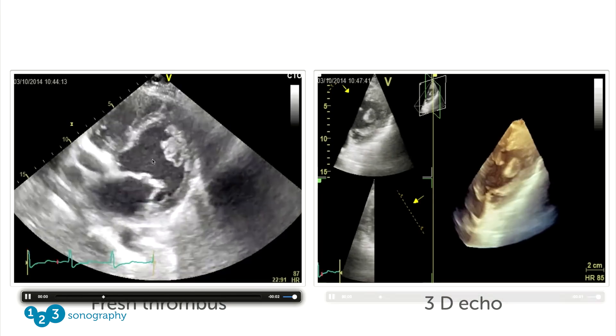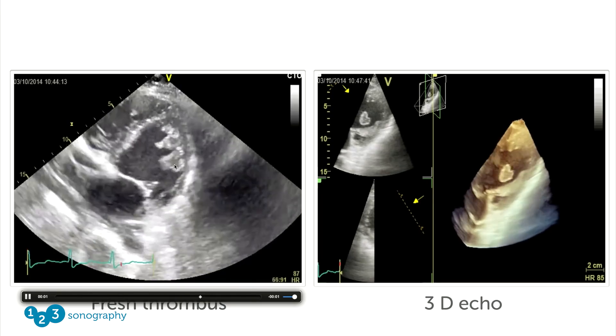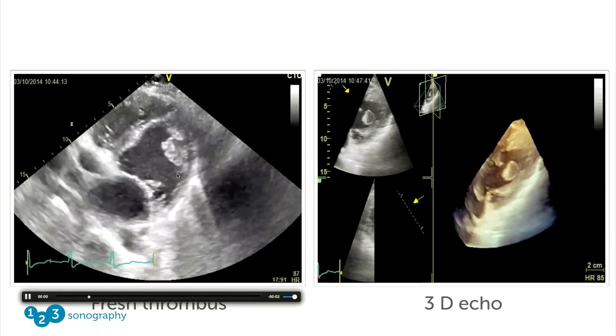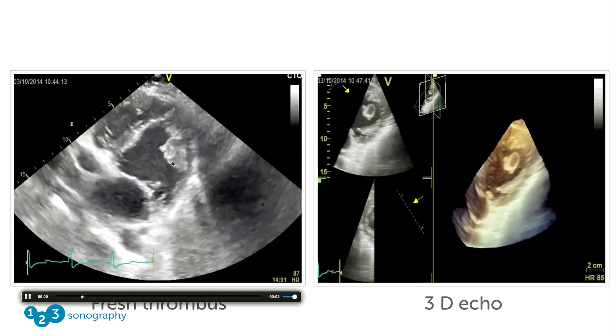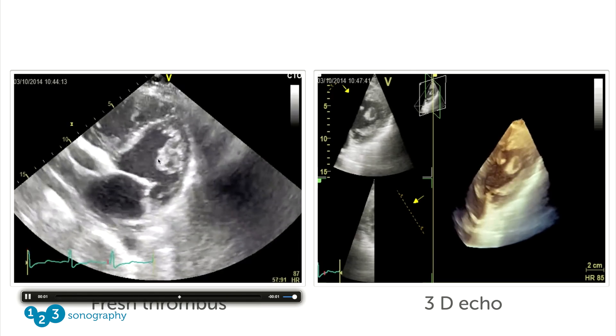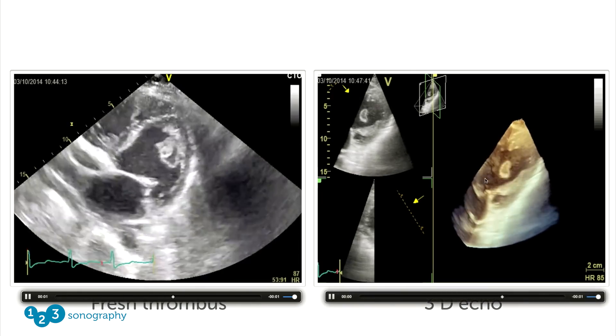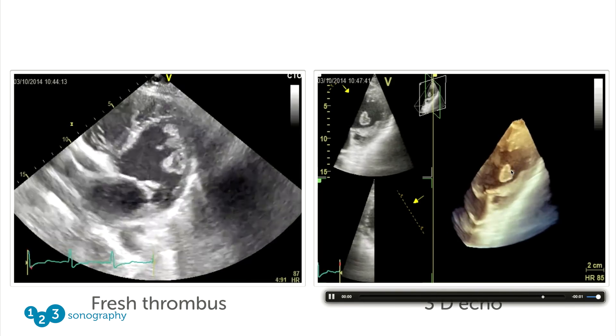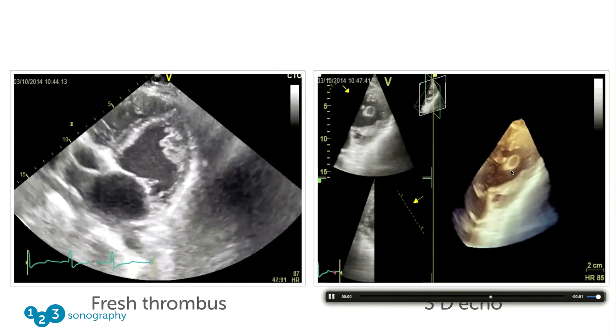Thrombi can look quite different depending, for example, on whether they're old or fresh. In a fresh thrombus, you will see that the thrombus is usually very mobile and has inhomogeneous and echolucent parts. This looks quite scary. Take a look at the 3D image which shows you how mobile the thrombus actually is.